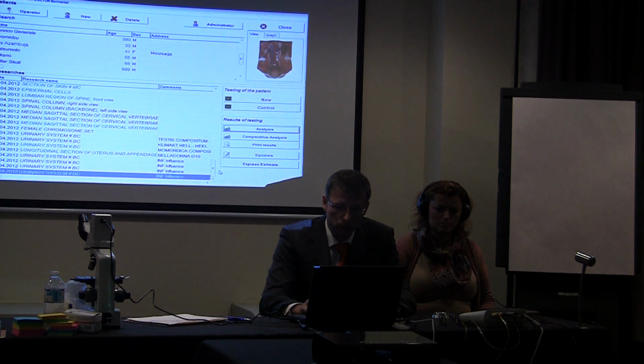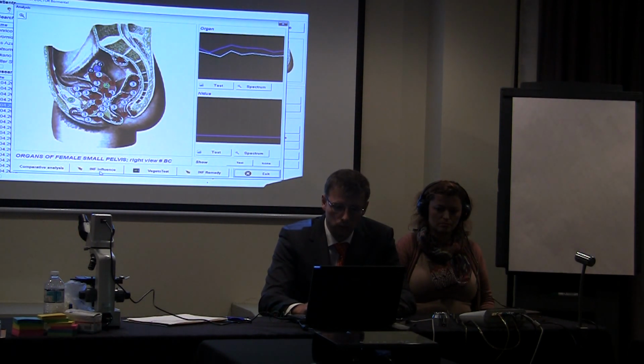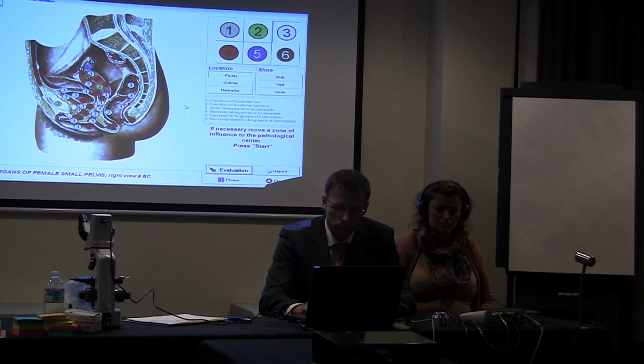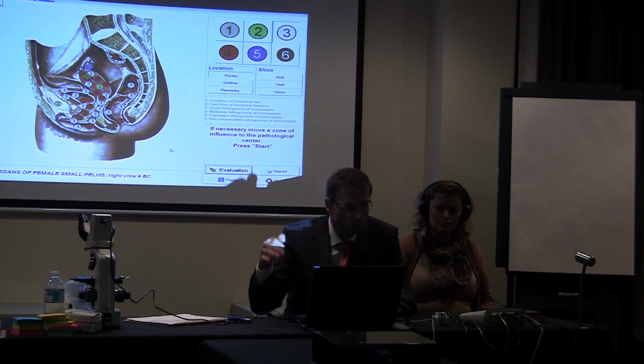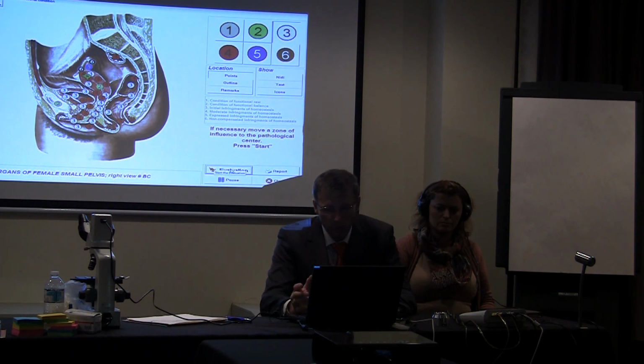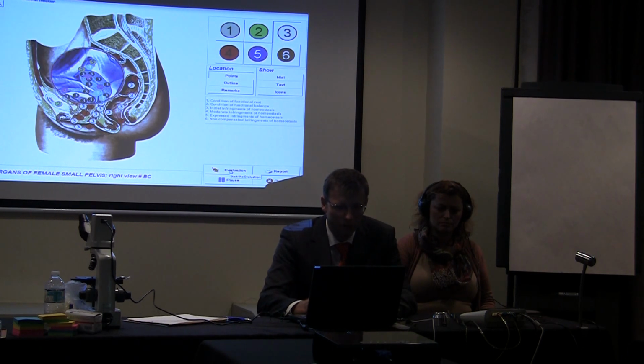We can go to another organ and make influence here. We can do it for more than one organ at one time. Yes, so it's okay to make it for 5 or 10 or maybe 15 organs. It depends on your time, on the time of the patient, and on his problems. But we advise to use this function not only one day. We advise to use it for 10 days, every day, maybe with a pause for the weekend. It depends on your working graph.